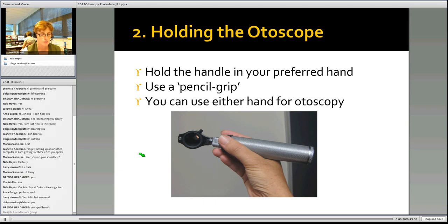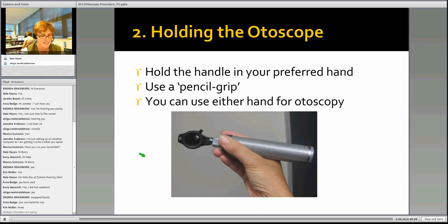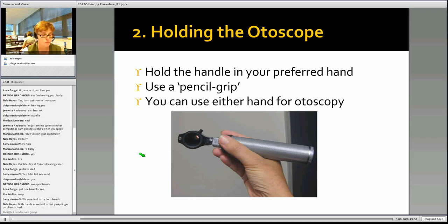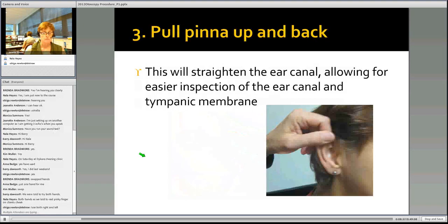Swapped hands, Brenda. You're very clever. And it's like me, just one hand. Barry, you're told to try both hands. So that's not a bad thing, as long as you use the correct grip. That's correct, Nala, that's right. And I'll just show you on the next slide of what that means. Oh, sorry, the one after. And Abiga uses both hands.